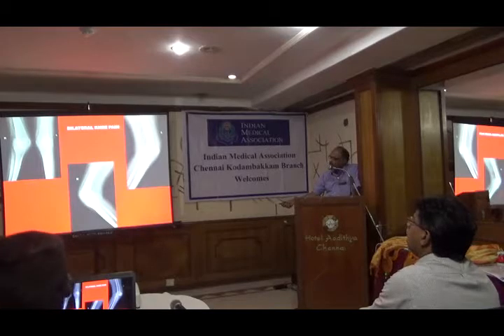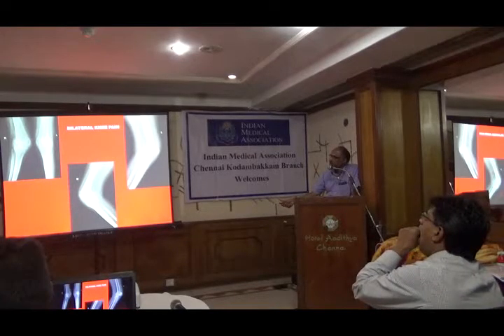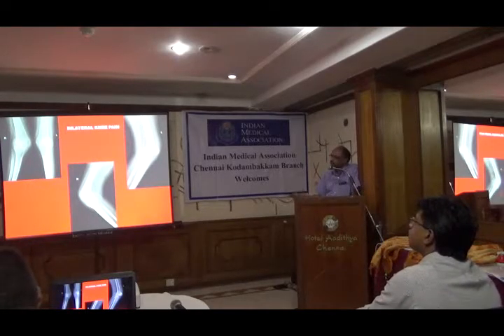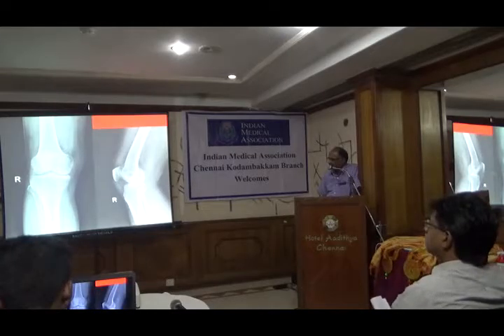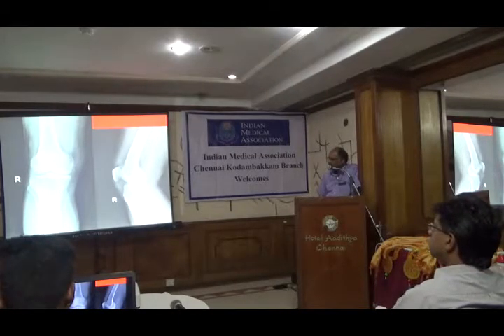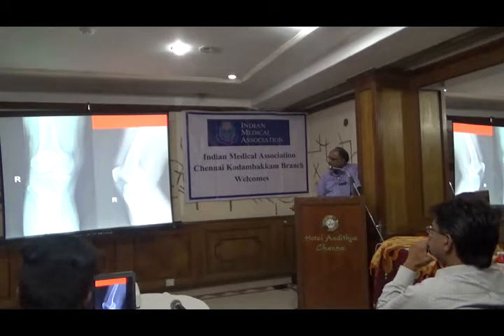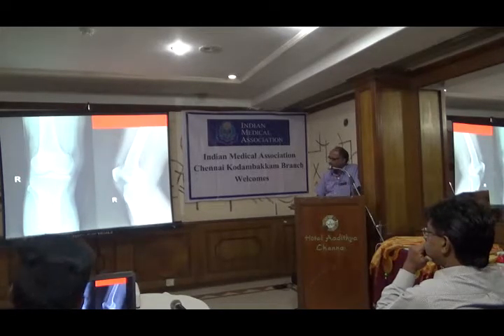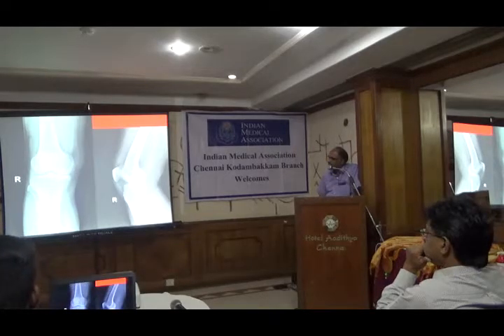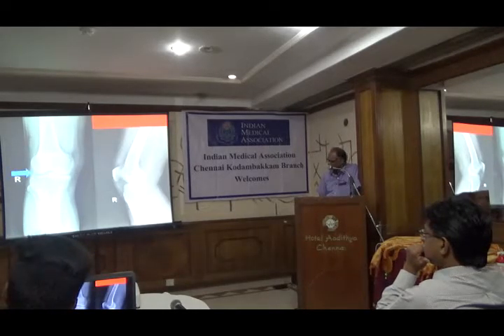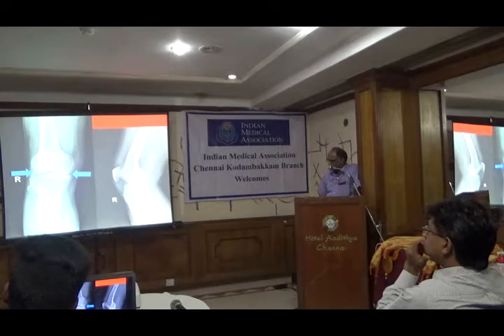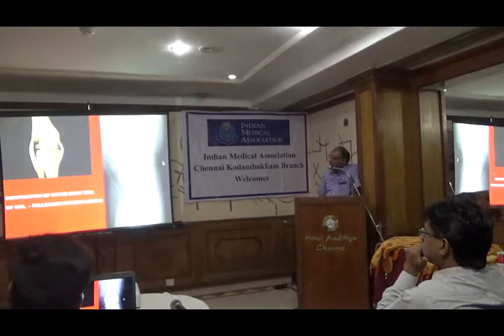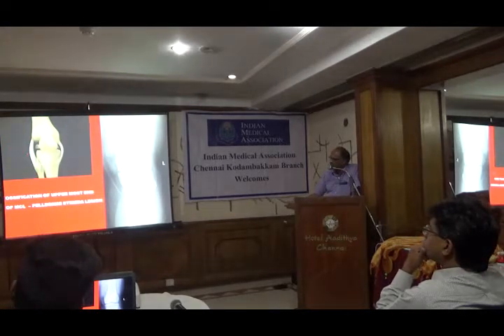Here is another knee pain case where the joint space is very much reduced. In this case, you definitely have to do an MRI to find out the status of the cartilage and cruciate ligaments. This is the indication for going to a higher modality like MRI after preliminary screening with X-ray. Here you also see a chip fracture, along with reduction in joint space on the medial aspect, which is causing the pain.